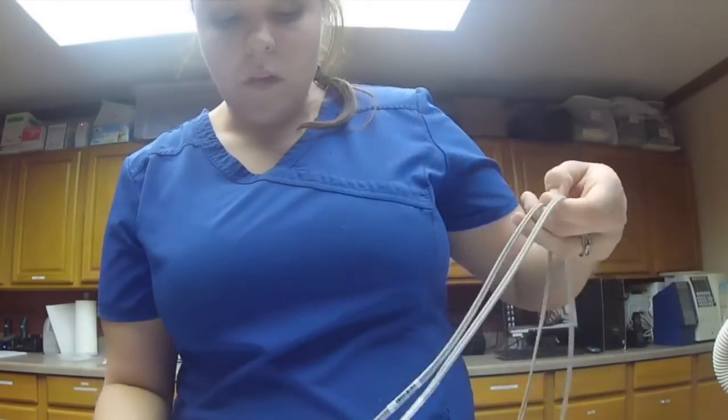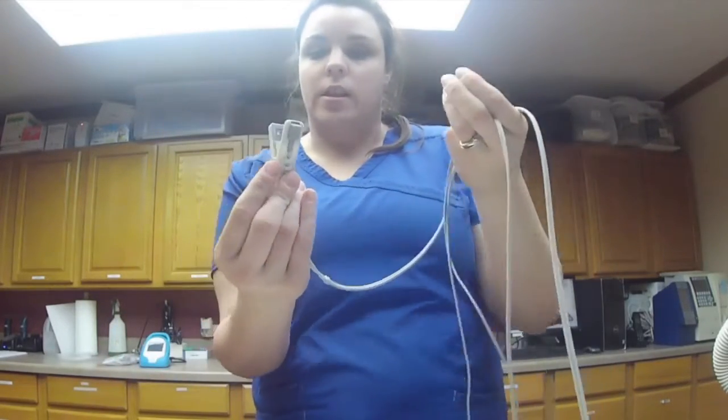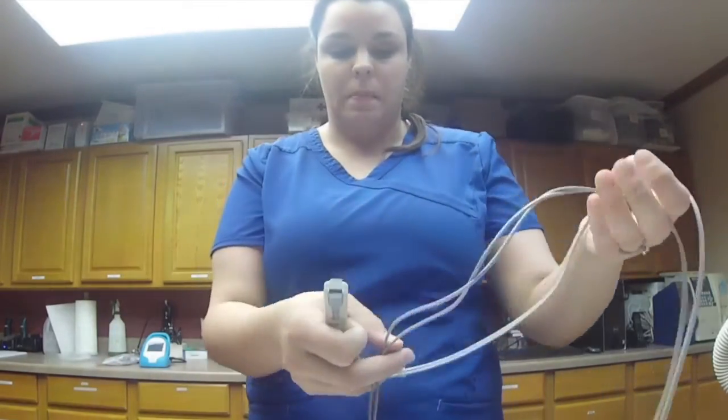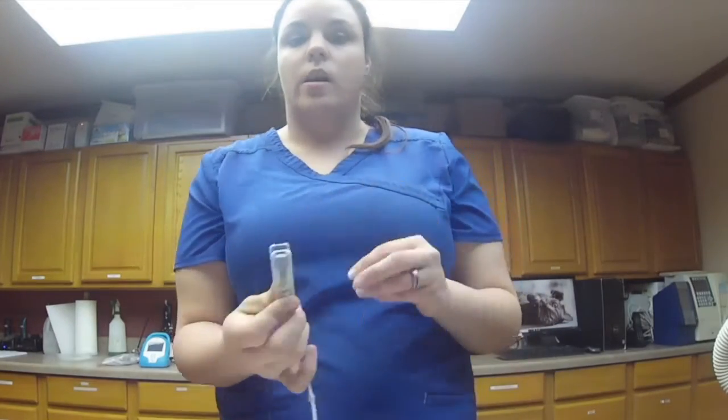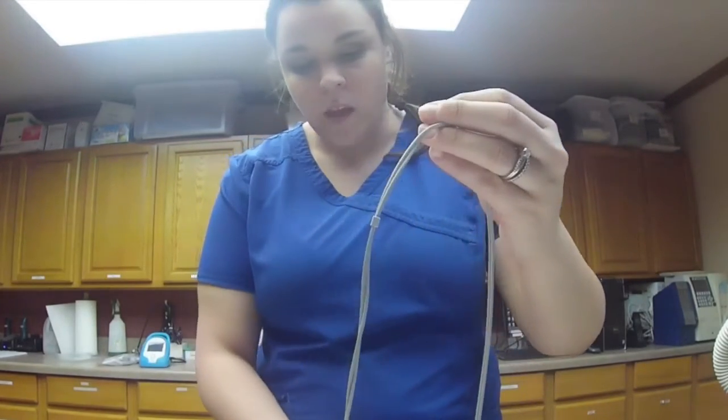So on the leads, what you will do is attach this piece to a dog's tongue, a dog's ear, or even a cat, or their tail, depending on where your procedure is, depending on if they are intubated or not. And then you have two cords for your ECG part.